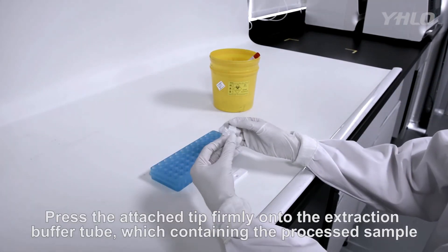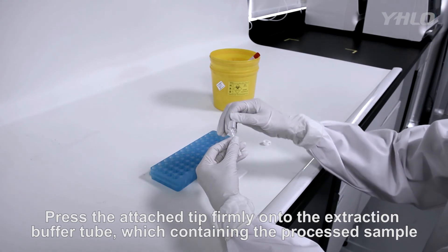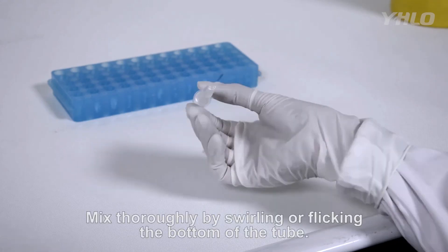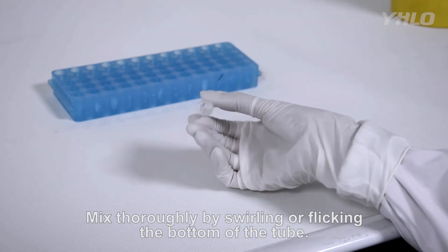Press the attached tip firmly onto the extraction buffer tube containing the processed sample. Mix thoroughly by swirling or flicking the bottom of the tube.